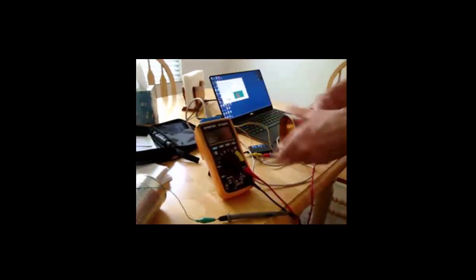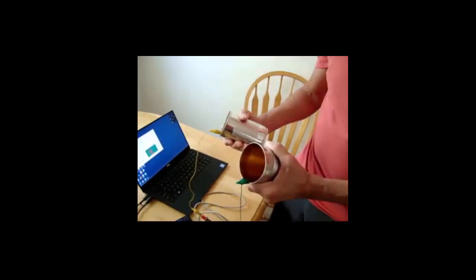E-meter conductor. So as I hold this, now you can see that that's my skin conductance varying, and the variation is really due to my pressure in holding that. If I release one, of course it goes to absolute resistance, pretty much.